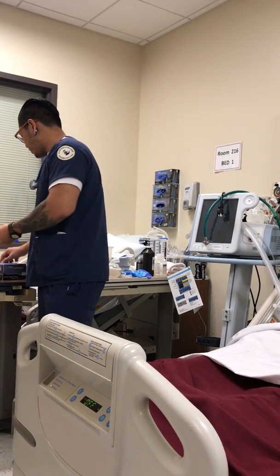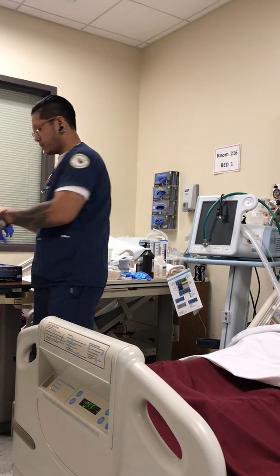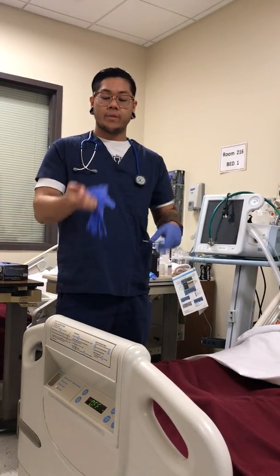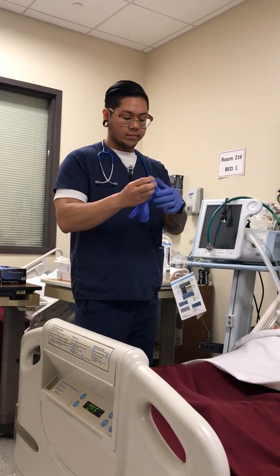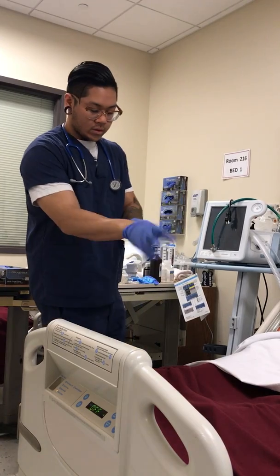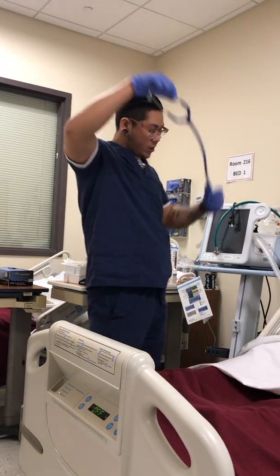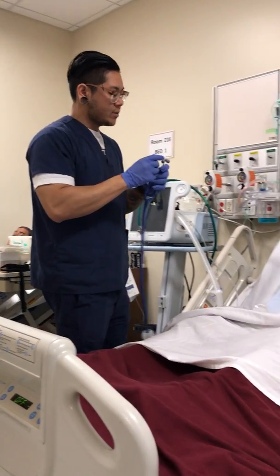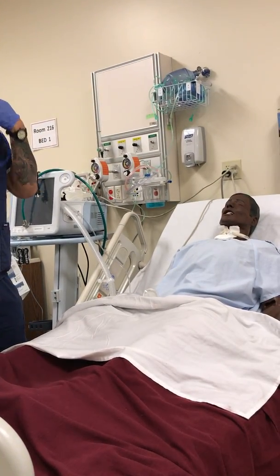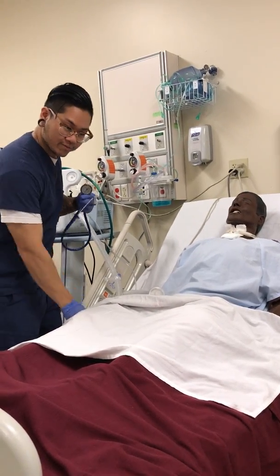So, put on some gloves. First thing I'm going to do is assess the patient. Okay, so I'm just going to take a listen to your lung sounds. And we're going to put a pulse ox on the patient too.